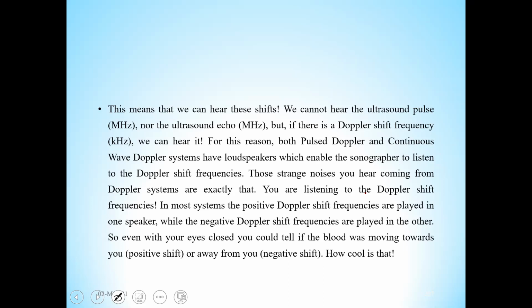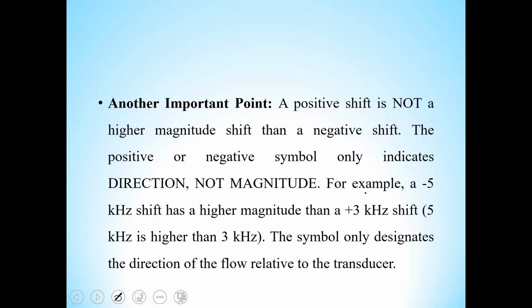In most systems, the positive Doppler shift frequencies are played by one speaker, while the negative Doppler shift is played by another speaker. So you can see most of the machines are provided with right and left speakers, and each of them represents the positive and negative Doppler shift.